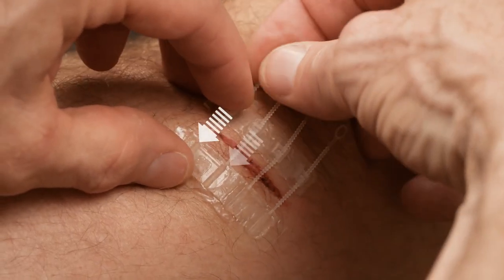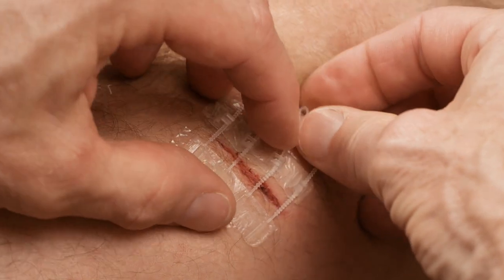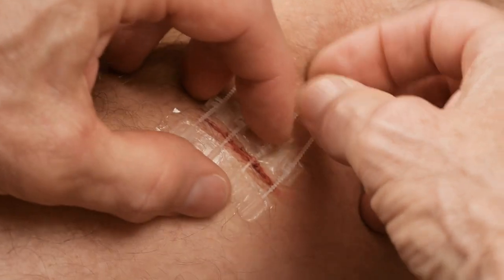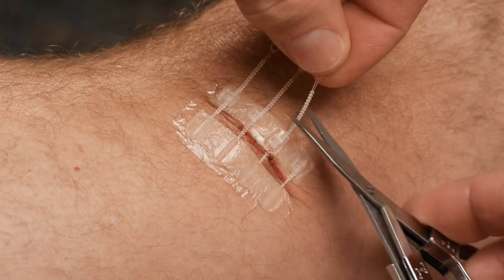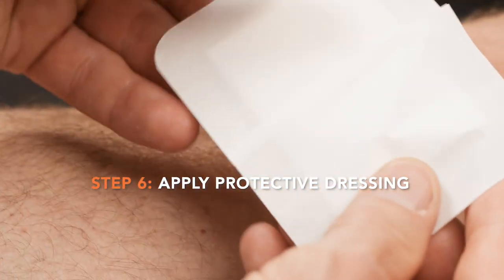Gently pinch the wound closed while pulling on the straps. Don't over-close the wound — stop when the edges of the wound touch. If you have clean scissors available, you may cut the excess straps.